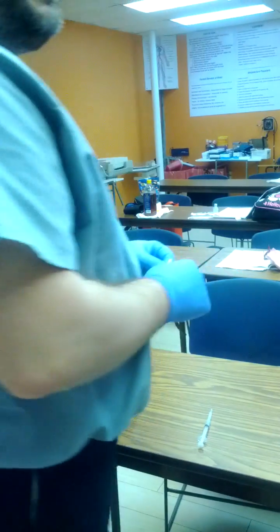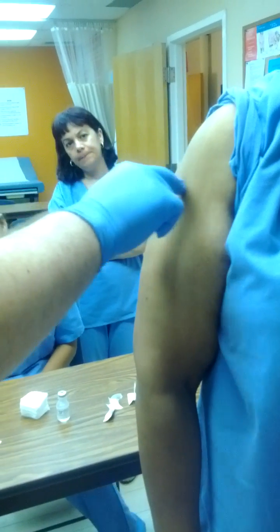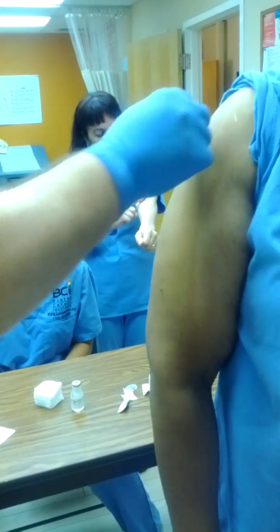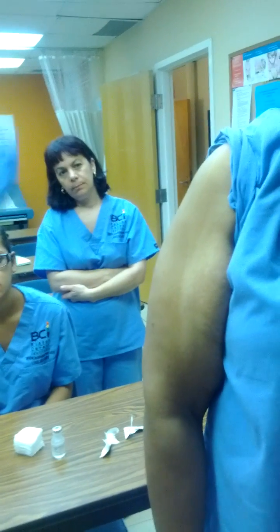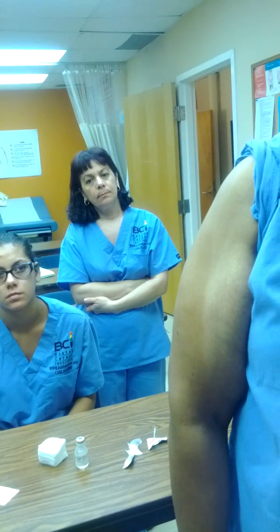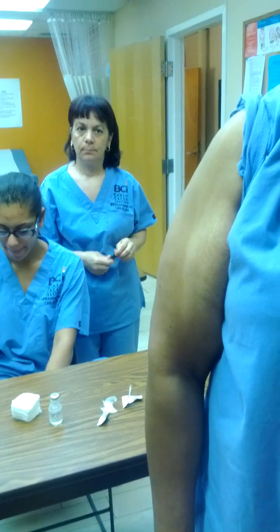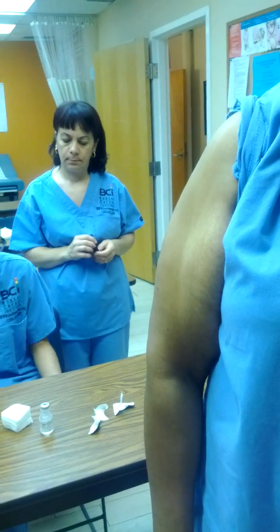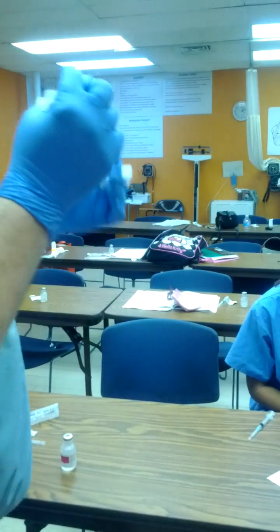We're doing an intramuscular injection and we're going to be doing it in the shoulder muscle called the deltoid. It's called the deltoid because it looks like the Greek letter delta, which is nothing more than a triangle. We're going to try to hit the middle of this particular big muscle right over here. I'm going to clean my site with alcohol — notice how big my circle is. I'm going from the inside out, pushing the dirt or whatever else is on the side from the inside to the outside, and I'm going to let it air dry. The longer the alcohol stays wet, the cleaner the site is. Do not use anything to dry the site of the injection — let it dry by itself. I'm going to take my left hand with a couple of pieces of gauze between my index and middle finger. I'm going to take my syringe and hold it just like a dart with the bevel facing up.